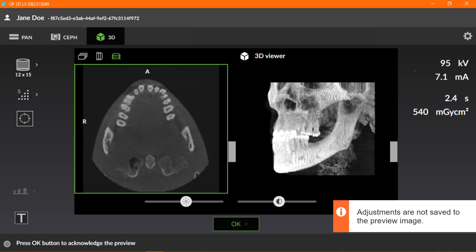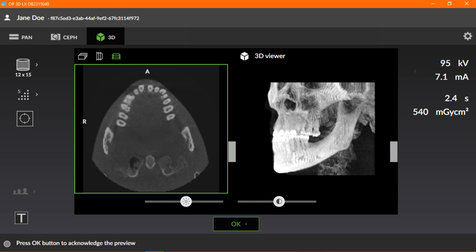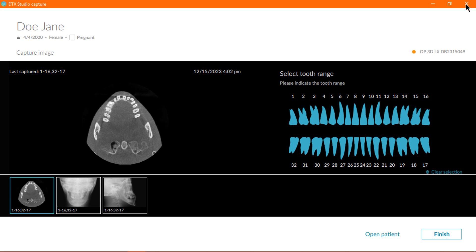Now, let's move on to the next section. In our last section in this course, let's look at saving the image we just captured. Once you've finished your review using the Quick Compose and you're satisfied with the data captured in the 3D scan, click the OK button to complete the image acquisition and save the image. Close the imaging program by clicking the X in the upper right corner. Click Finish to return to the DTX home screen.